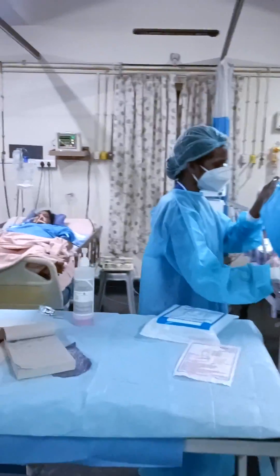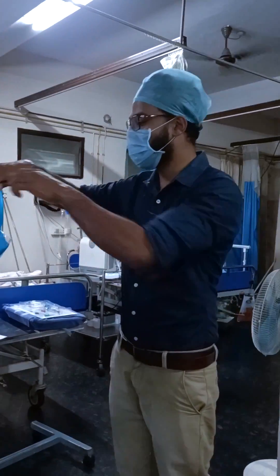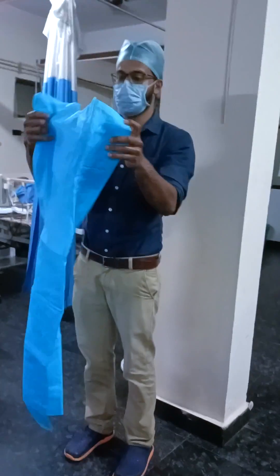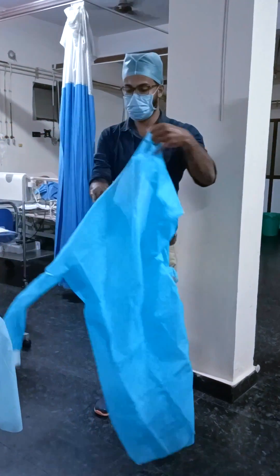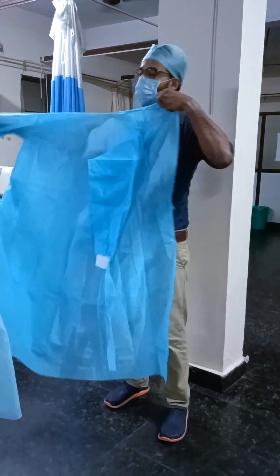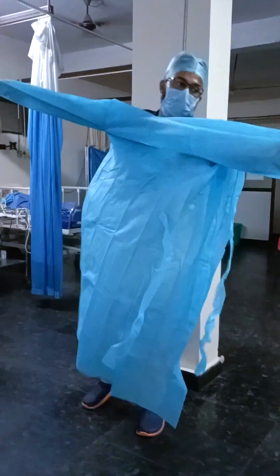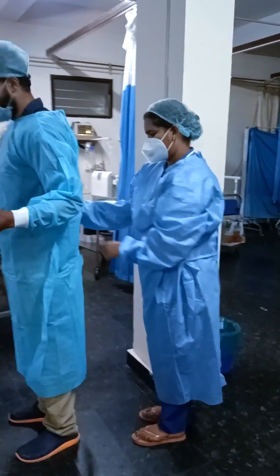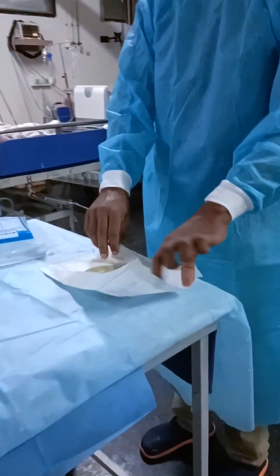Hi, I'm Dr. Jijo Martin. Today I'm going to be doing dialysis catheter insertion into the internal jugular vein using Seldinger technique. This is a sterile procedure. I have done my hand washing and now I'm putting on a surgeon's gown and wearing a pair of sterile surgical gloves.